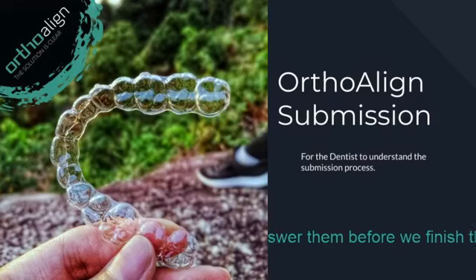upset in the patients. So inspect the impressions for voids, areas that are not captured properly, and distortion. Make sure it is a clear and distinct impression, especially on the anatomy or the occlusal of the teeth and the gingival margins of the teeth. Those are very important. It should also be adequately extended, so make sure you capture as much of the sulcus as you can. Preferably it will be at least more than 2-3 millimeters above the gingival margin, maybe even 4 or 5 millimeters. The more you have of the sulcus, the better. You never want less.